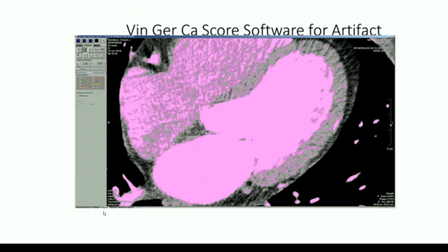There's adequate collateralization. We can actually show you the image if you hold on for a minute. We'll get the CT image up. So that would be Vince Gerasitano. We should have to query G-E-R-I-C, and it should come up.